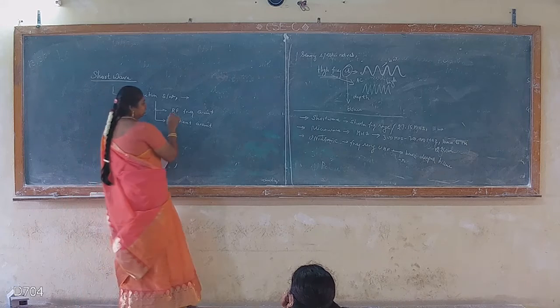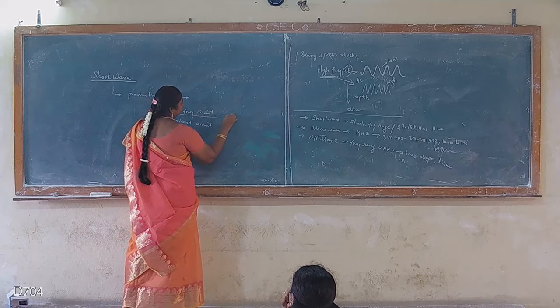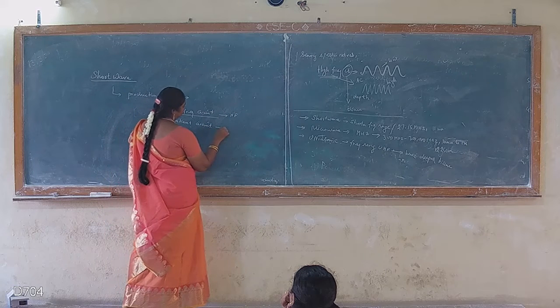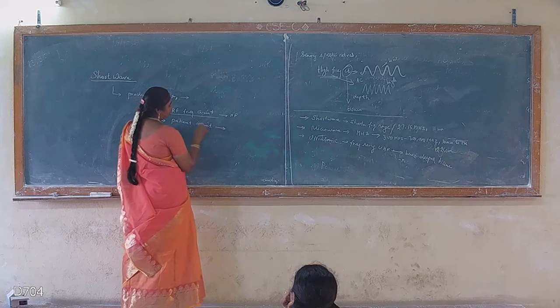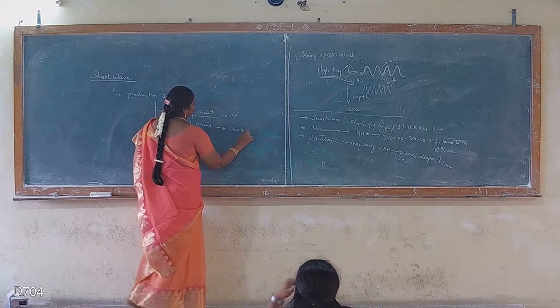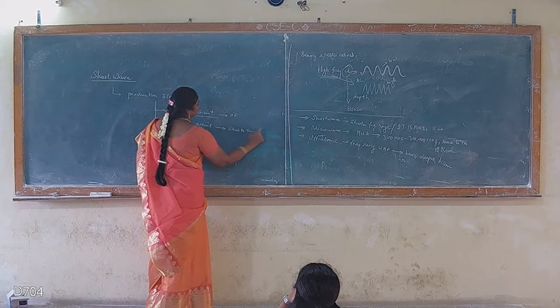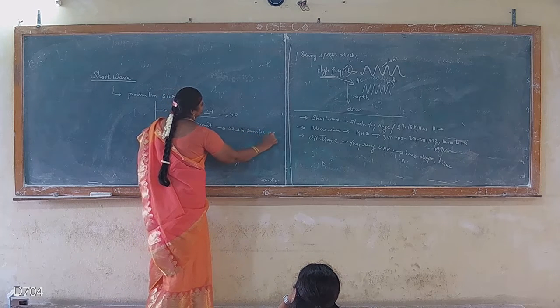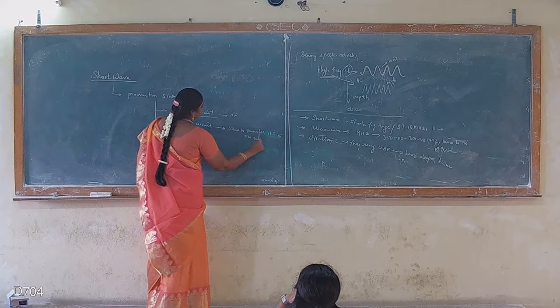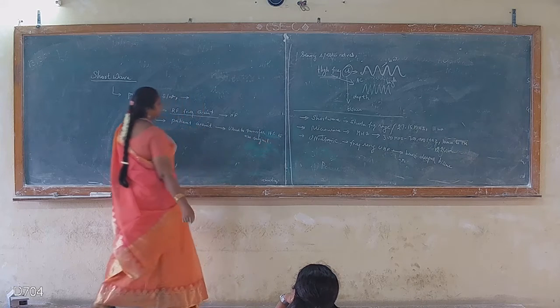One circuit is used to generate a high frequency current. The other circuit is called the patient circuit or resonator circuit, which is just used to transfer the high frequency current to the subject. So how are these circuits constructed basically?